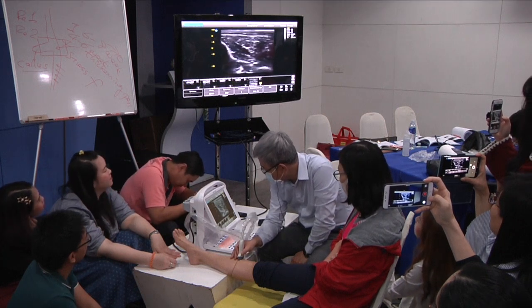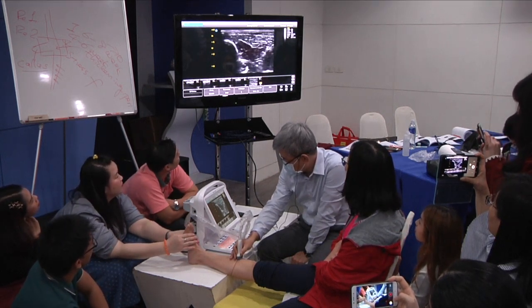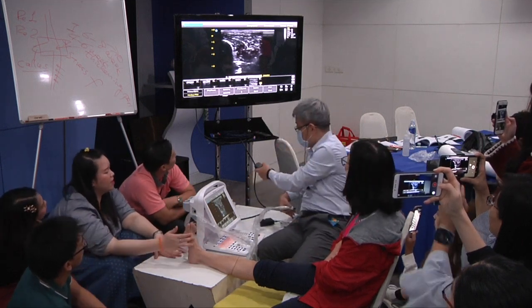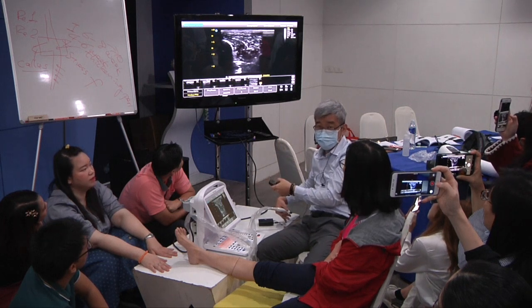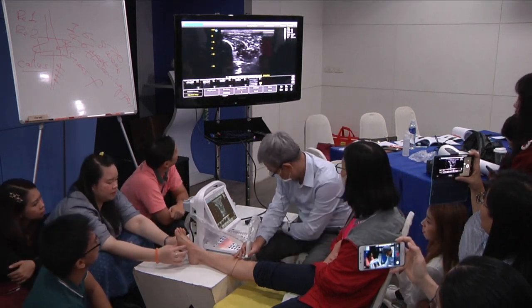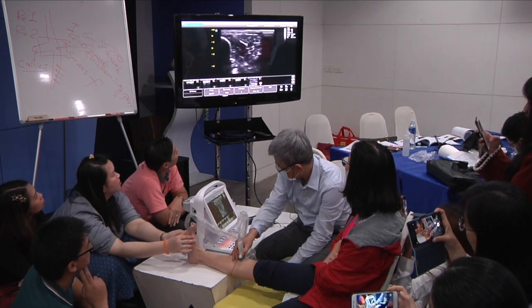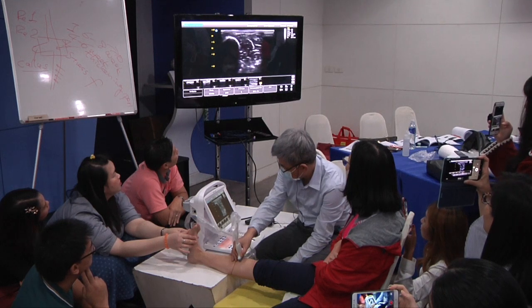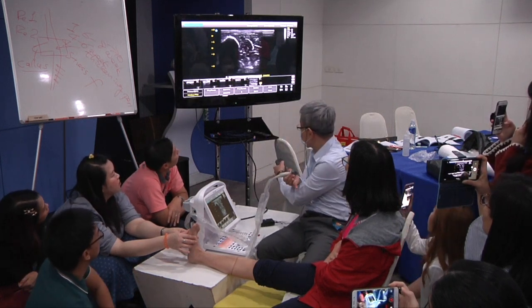Okay. So hold her foot for me again. There. Okay. Dorsiflexions. Good. Okay. The edge, thank you. The edge of tibialis still stays here. If the edge of the tibialis moves away from the tibia, that is an anterior tibialis herniation. Let's do it again. Dorsiflexion. Go. Yeah, still stays with tibia. If the muscle ending leaves or goes away from the tibia, that's the muscle herniation.